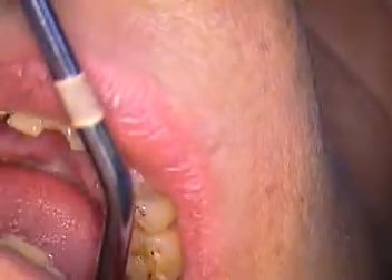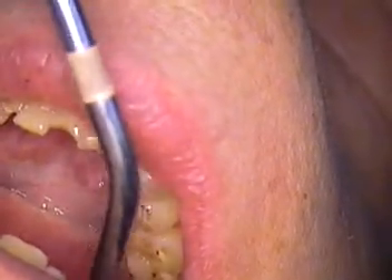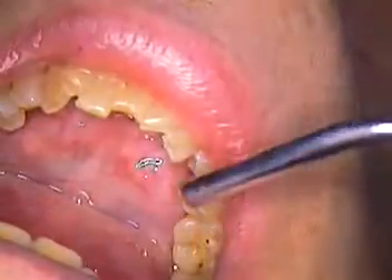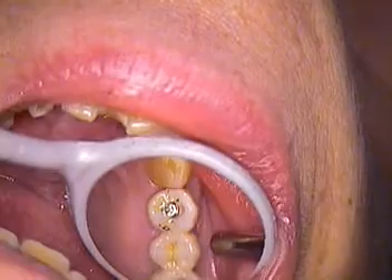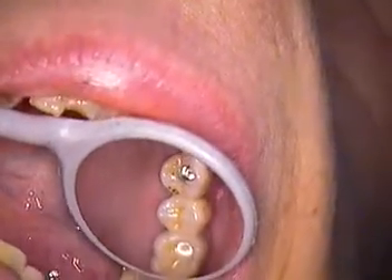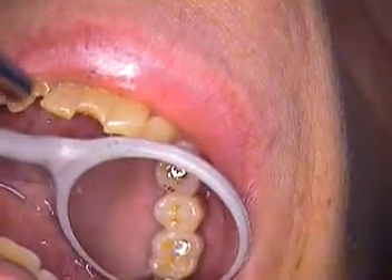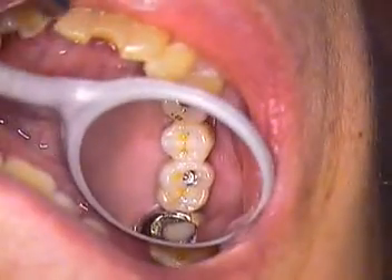Hello, this is Dr. Jerry Cuomo. I'm here in my Boca Raton office with my patient, Margarita. She's enjoying her new dentistry. This is the state-of-the-art technology from my laboratory in Massachusetts.